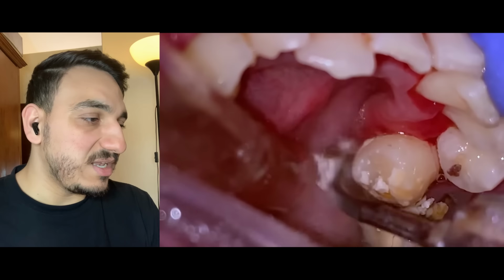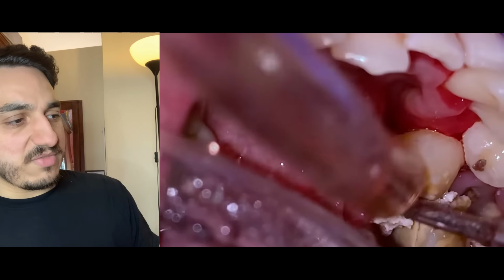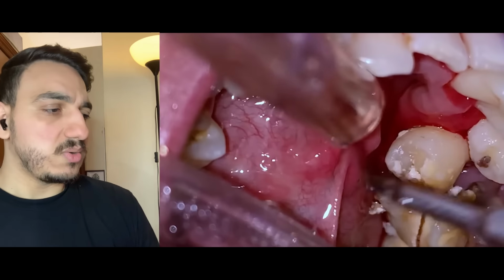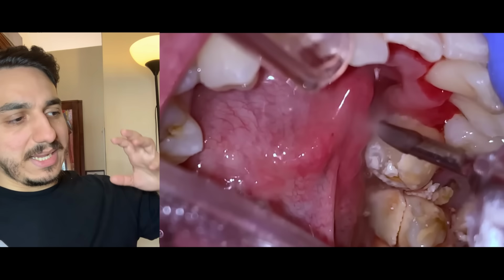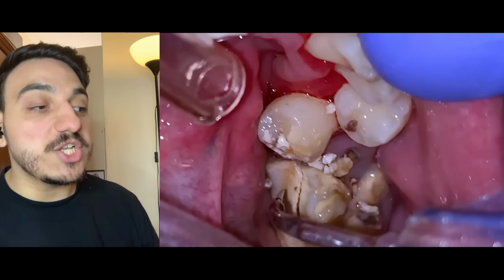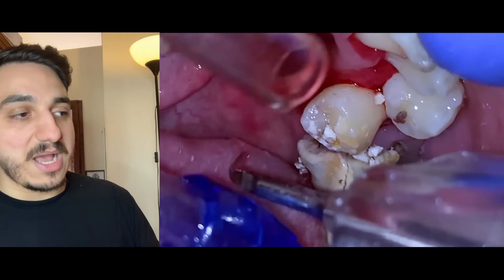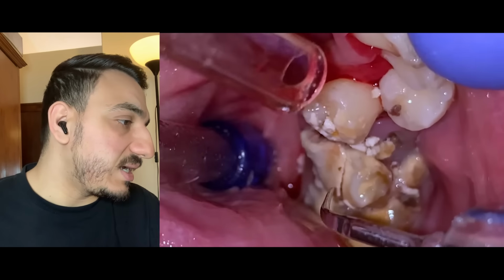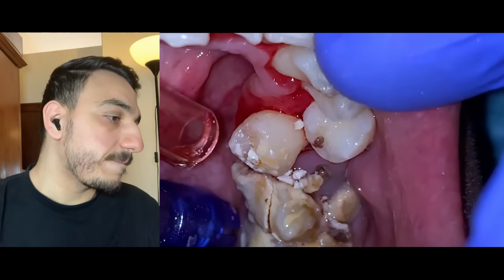It's a bit deep, so the assistant is gently pushing the floor of the mouth down, because the floor of the mouth is not only really sensitive, but it also has a really good vascular supply, and hence any damage to it can result in subsequent extensive bleeding.